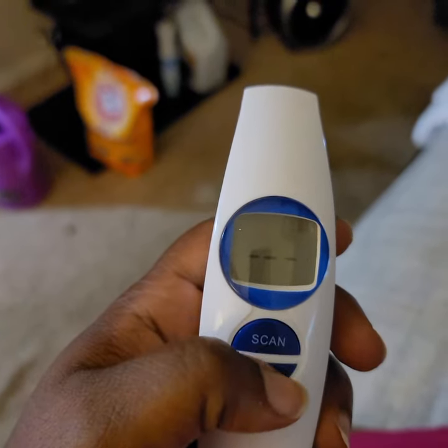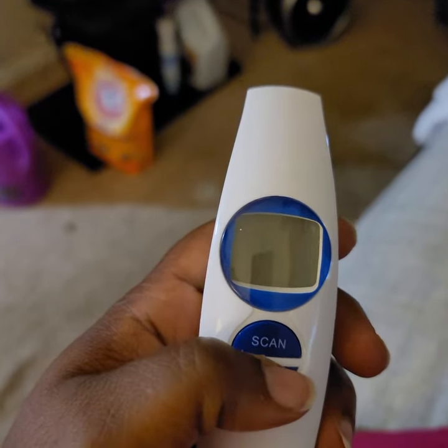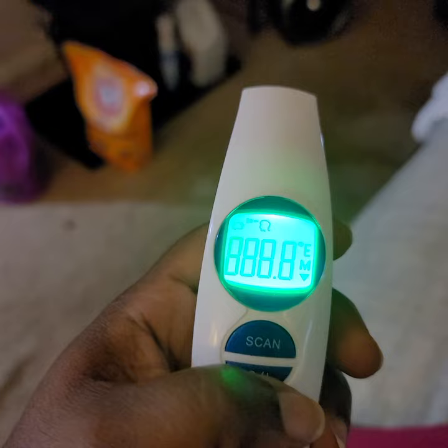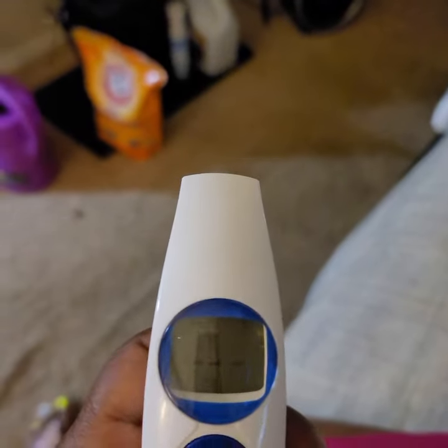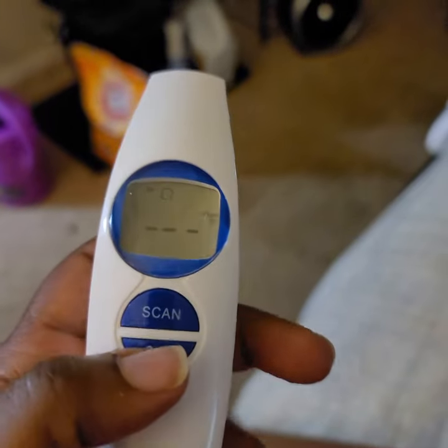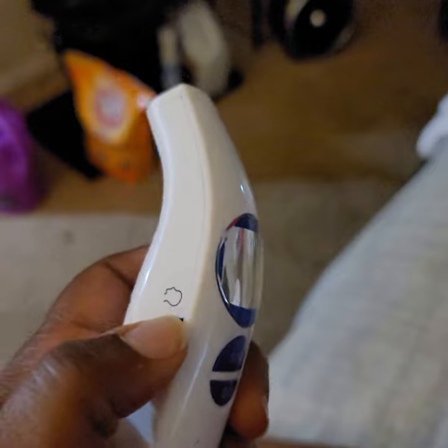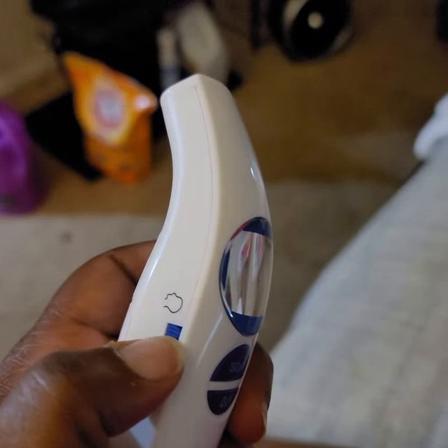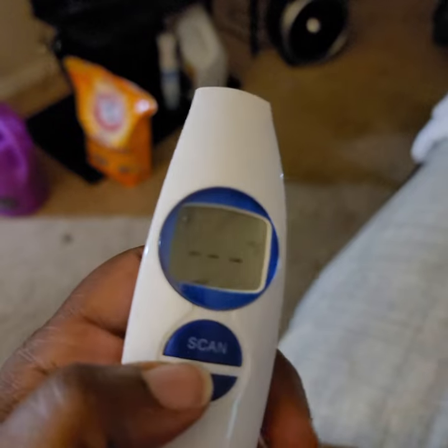The reason I made this video is because it took me literally forever to figure out how to do that, and it was not easy — you're pressing all the buttons. Oh, I didn't mention that you have to have it on body temperature mode in order to switch it over.